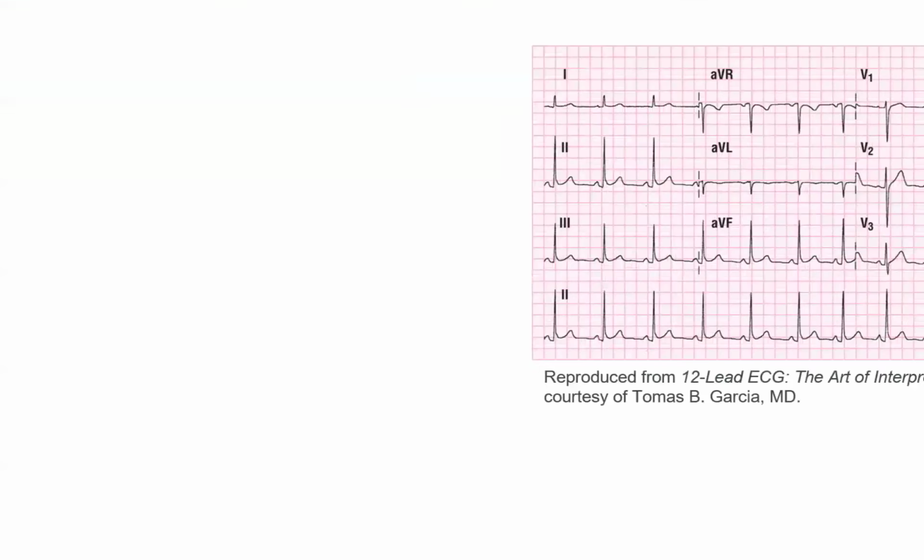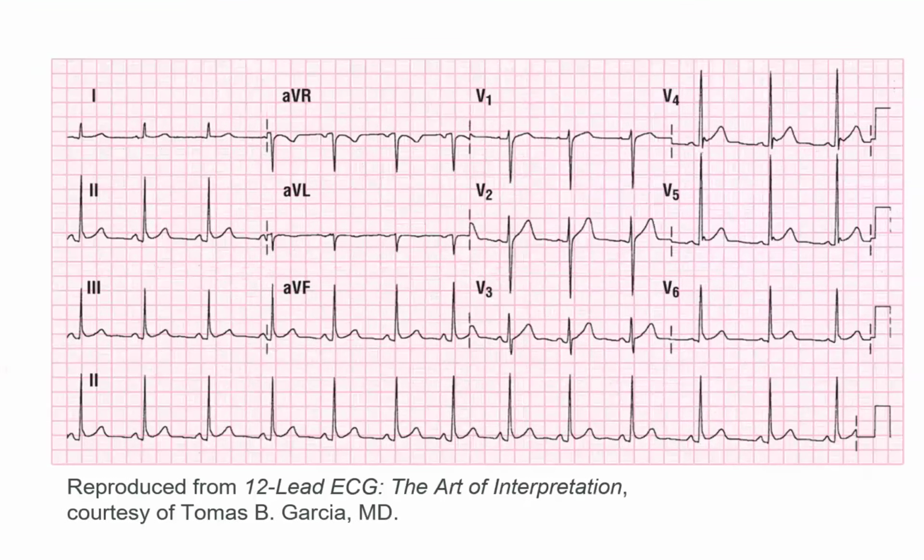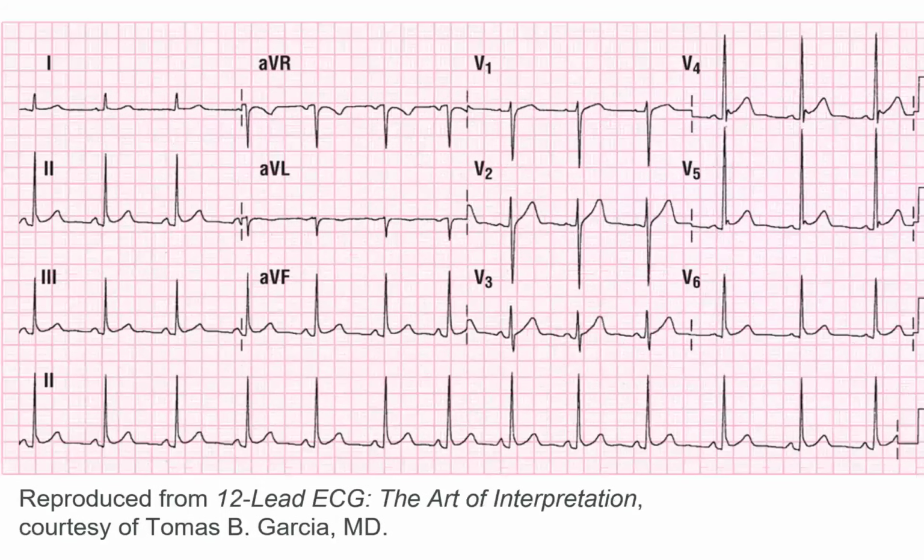So this is just so you know, we're probably dealing with a mimic, but we're gonna approach it the way we are. Do we have P waves? Underlying rhythm down there. PRI is equal and normal. RR is regular. All right. So we're in some sort of sinus rhythm. Check the rate. Sinus rate. 300, 150, 100, 75. You guys thought I was just guessing. So normal sinus, underlying rhythm.